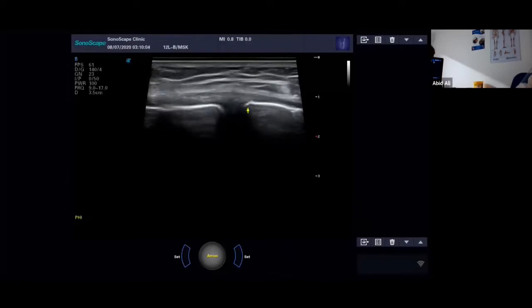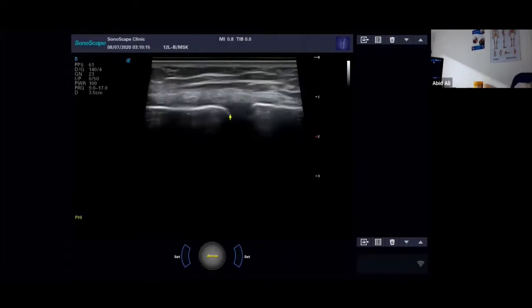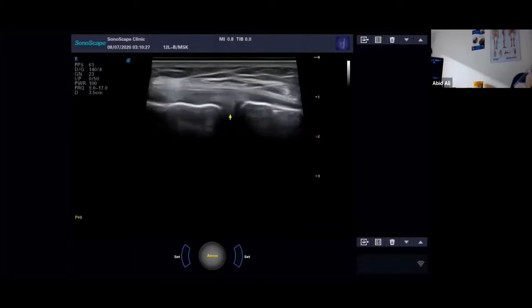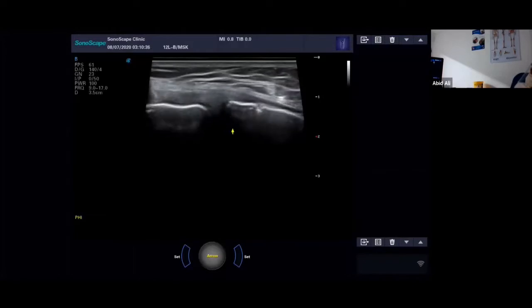In a healthy knee, what would you expect the joint space to measure? Oh gosh, you're asking me things that I don't tend to measure. What are you looking for? Erosions? Yeah, erosions. I can compare it if it's particularly narrowed, with reduced cartilage. There's a bit of cartilage here, but I just tend to eyeball it. What do you think, about 7-8 mil there?